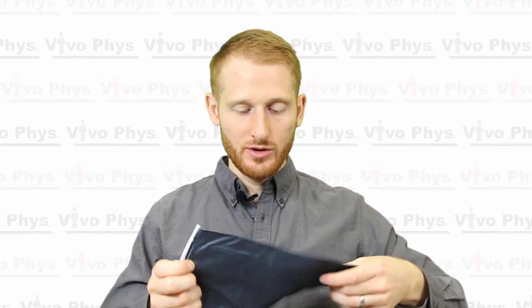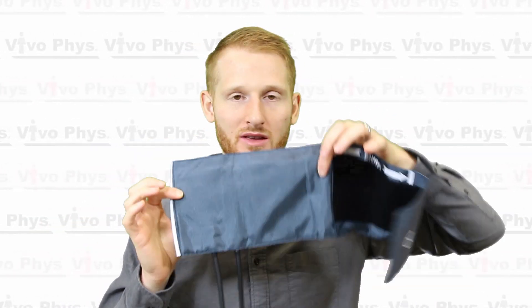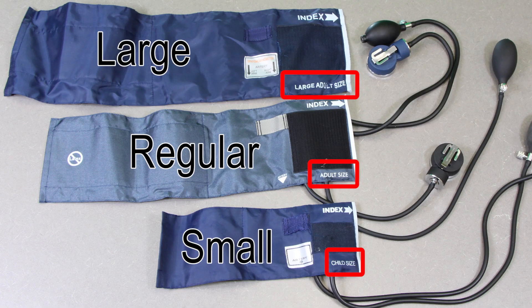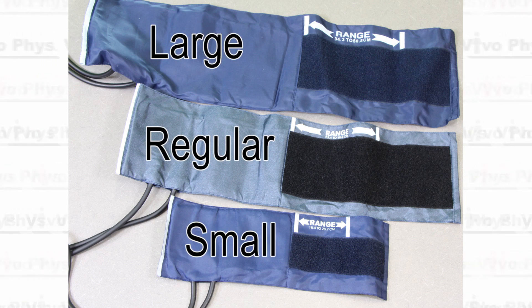Take a blood pressure cuff and make sure it is the appropriate size for your participant. You can feel the end of the air bladder inside the cuff. You want that air bladder, when wrapped around the upper arm around the bicep and tricep, to cover somewhere between 80% and 100% of the arm. If the air bladder overlaps on itself it is too big; if it doesn't go at least 80% around the arm, the cuff is too small.